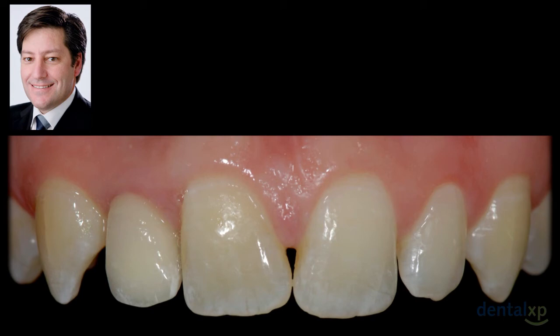Now, let's move on to the prosthetic part. I have shared with you the implant position, the importance of the maintenance of the surrounding tissues, and how to handle the soft tissue. I would like to share with you now some prosthodontic considerations. By now you all know where the implant is in here. That's not difficult to find. But what I'm saying is, oftentimes we send a prescription to the dental technician and we say, please fabricate an implant crown A2, A3. And I just wonder how a dental technician, with such complexity in the anatomy here, can fabricate a crown when we say just A2, A3. So for me, it's impossible.